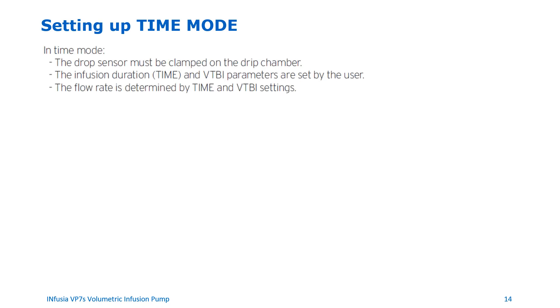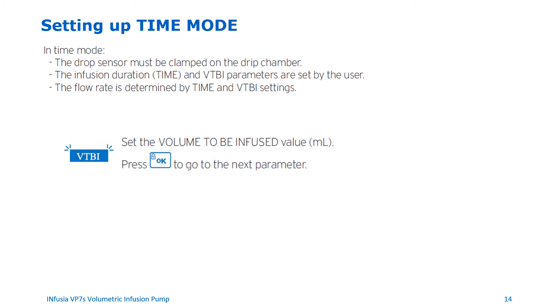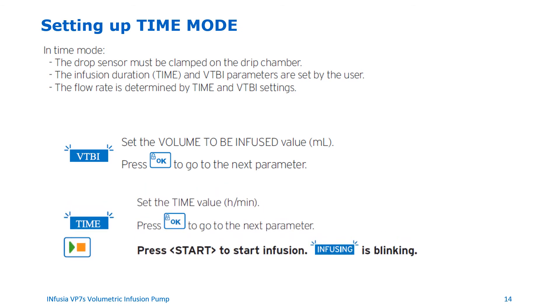Setting up Time Mode. For Time Mode to work, the drop sensor must be clamped on the drip chamber. The user can set the infusion duration and VTBI parameters; the flow rate is determined by the time and VTBI settings. To set up Time Mode: set the volume to be infused in milliliters, press OK to go to the next parameter, set the time value in hours or minutes, press OK, then press the start/pause button to start the infusion. The word 'infusing' will blink on the screen once the pump starts infusing.